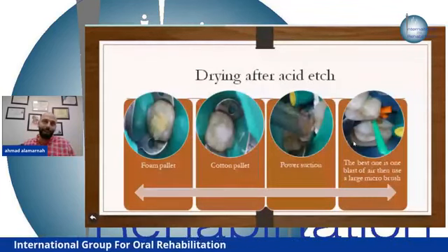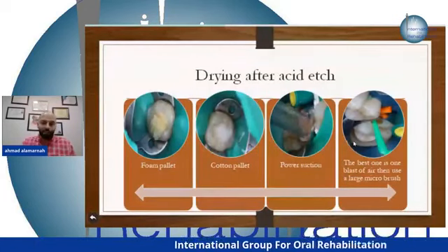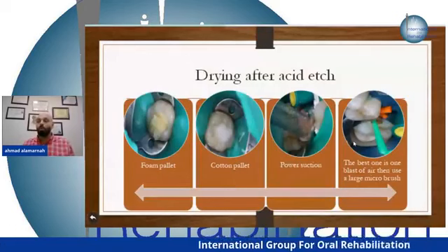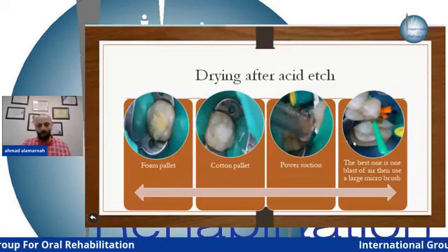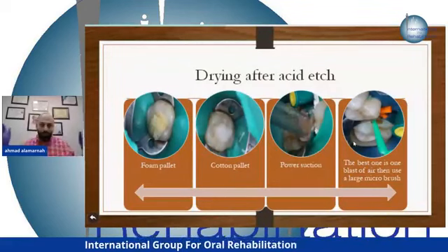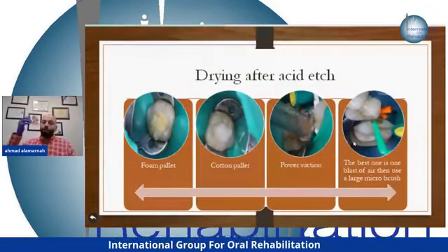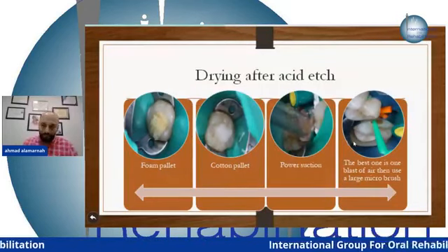So they add silica particles to the acid etching to thicken it, to make it more viscous, okay, to make it a gel. This increase in the viscosity will make it more retained to the tooth structure than the liquid one, okay? So if you only remove it with the power suction and think it's enough, no, you didn't remove it all. You have to remove it all. So you have to rinse it with a triple syringe with air and water for at least 30 seconds. Okay, doctor?